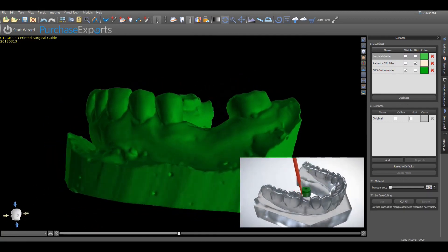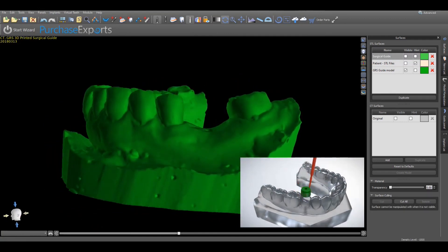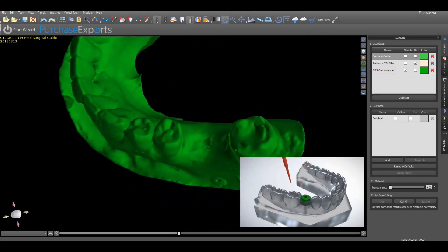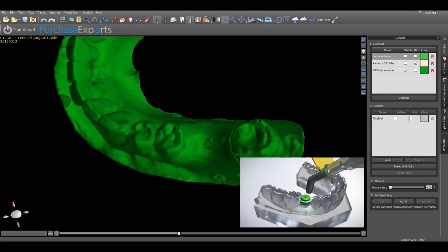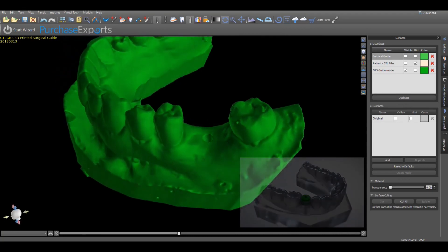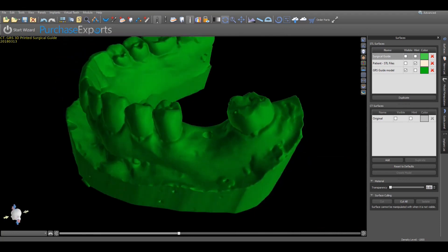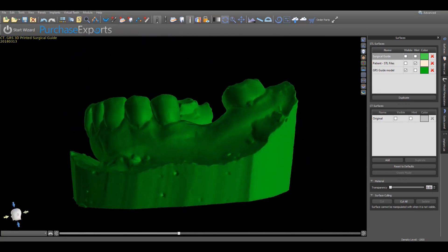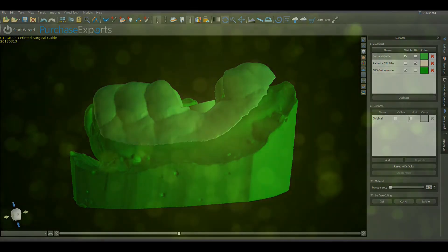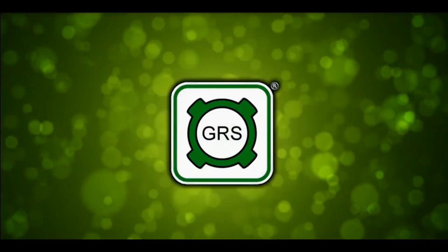Additional videos demonstrating how to affix the surgical ring to the surgical guide are available at grsguidesystem.com. Once completed, the newly fabricated GRS surgical guide will serve to provide the most accurate and precise surgical guide for dental implant placement.